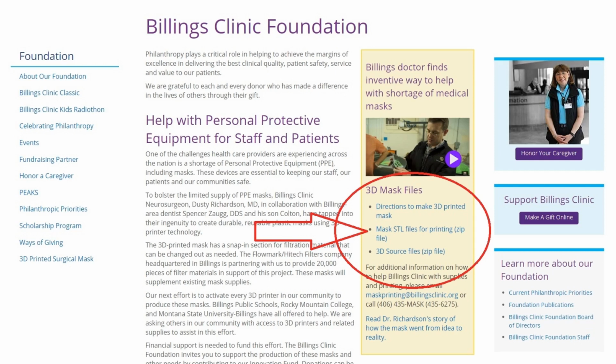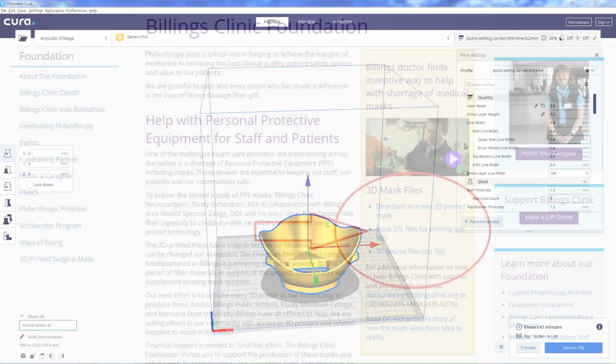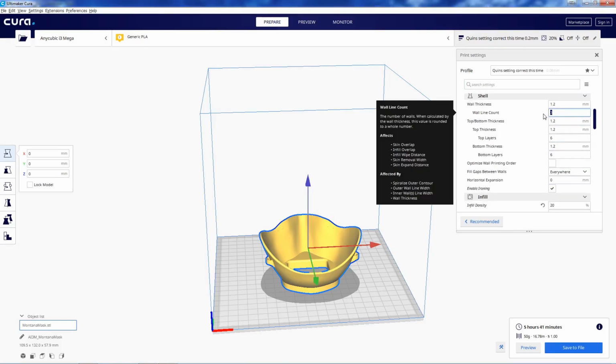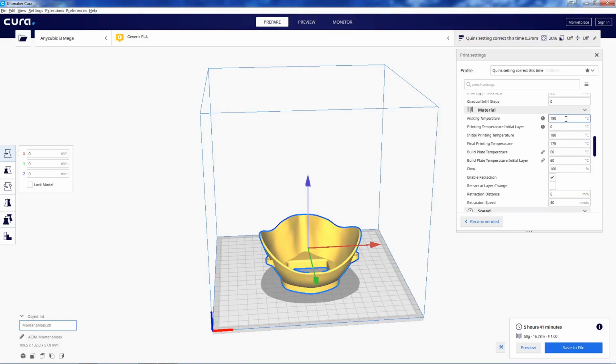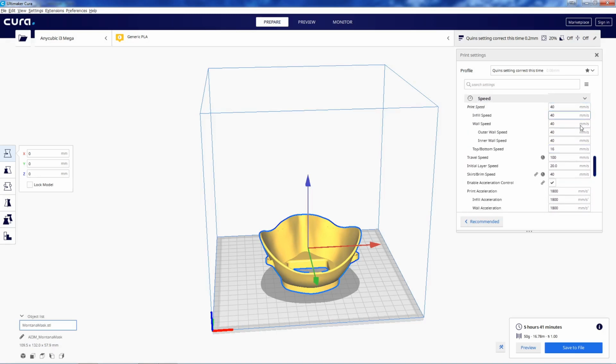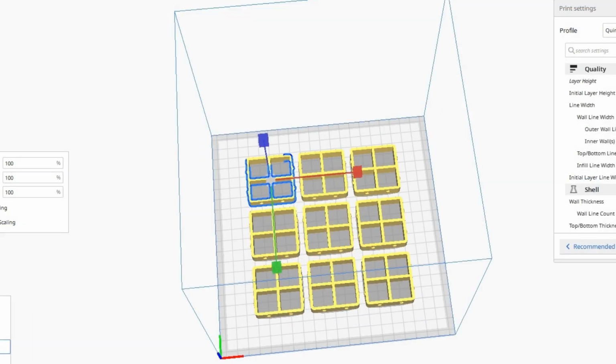The one in the middle is the STL files. You'll want the top one too though, because that explains how to do the filter part. The file is free and open to be edited if you want to. For my settings, I'm running 0.2 layer height, 3 walls, 20% infill, and here are my temps and speed. Jerk control is helpful. No supports and a skirt to prime the nozzle, but you do what works best for your machine. You can print the filter keeper thing in sheets of 9 like this.